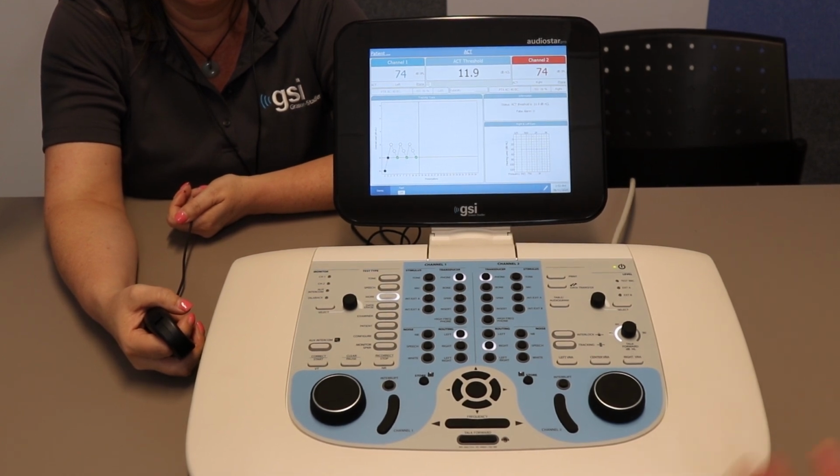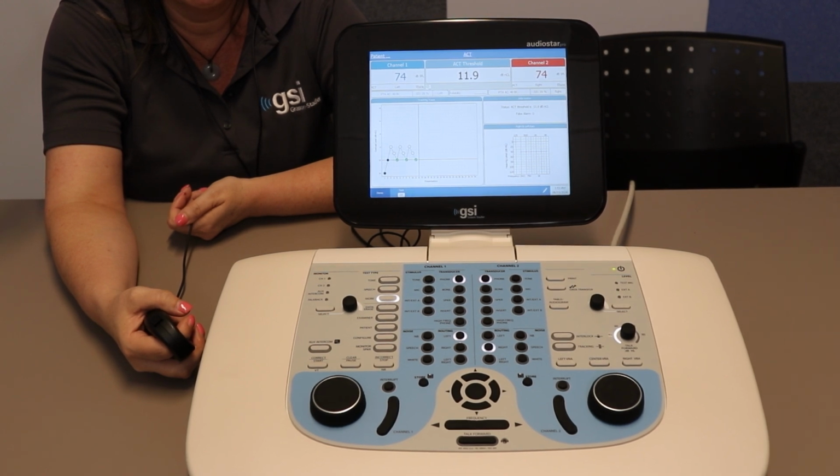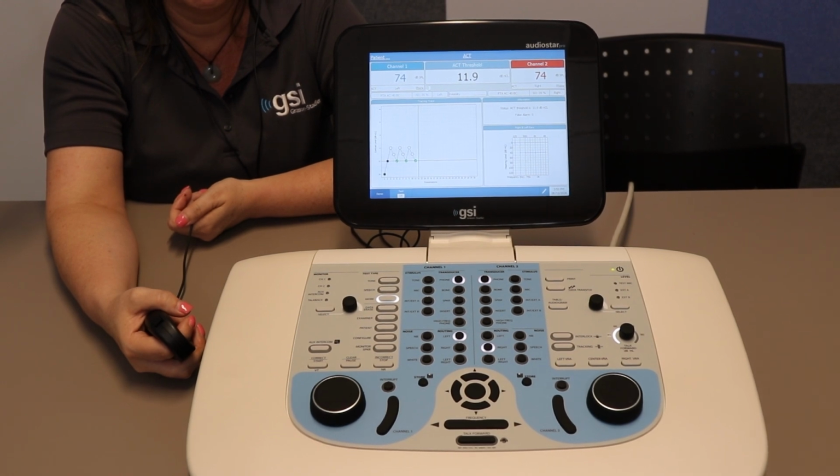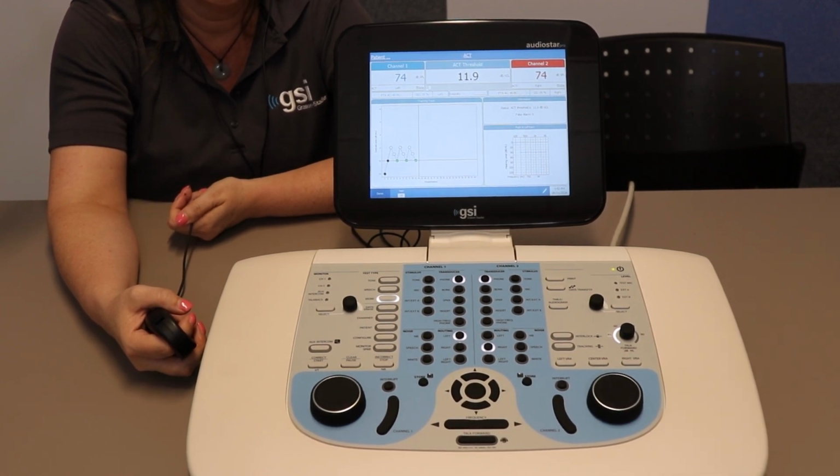We've got our threshold, and now we can take that number and move it into Oticon software to program their hearing aids directly, or we can refer to the guide that allows us to determine how we want to handle some of the more advanced features for our patients in the more complex listening situations that they get into.